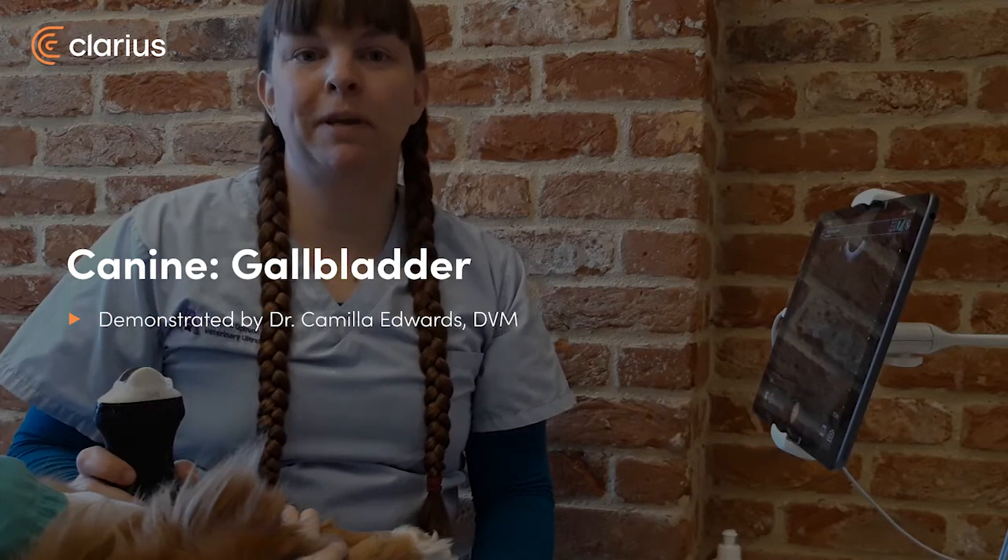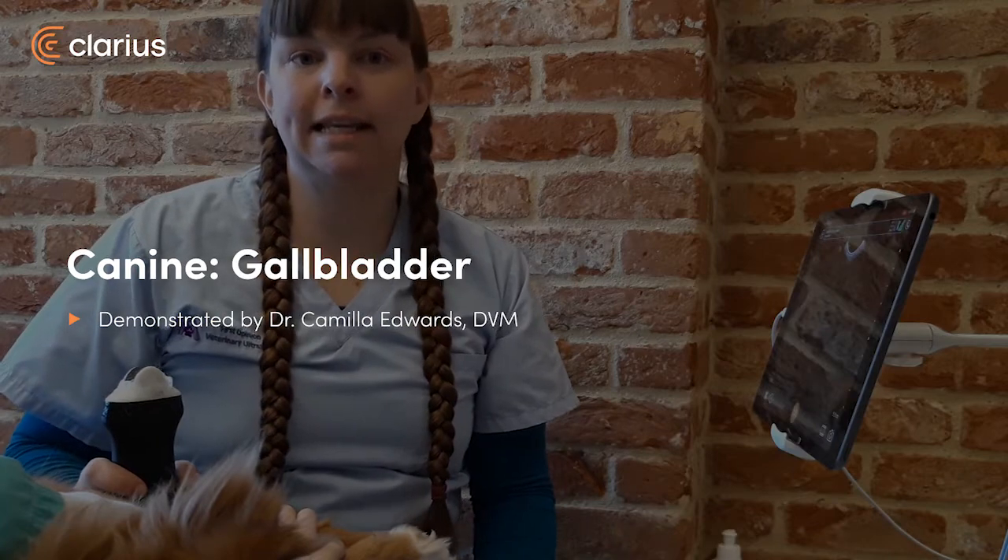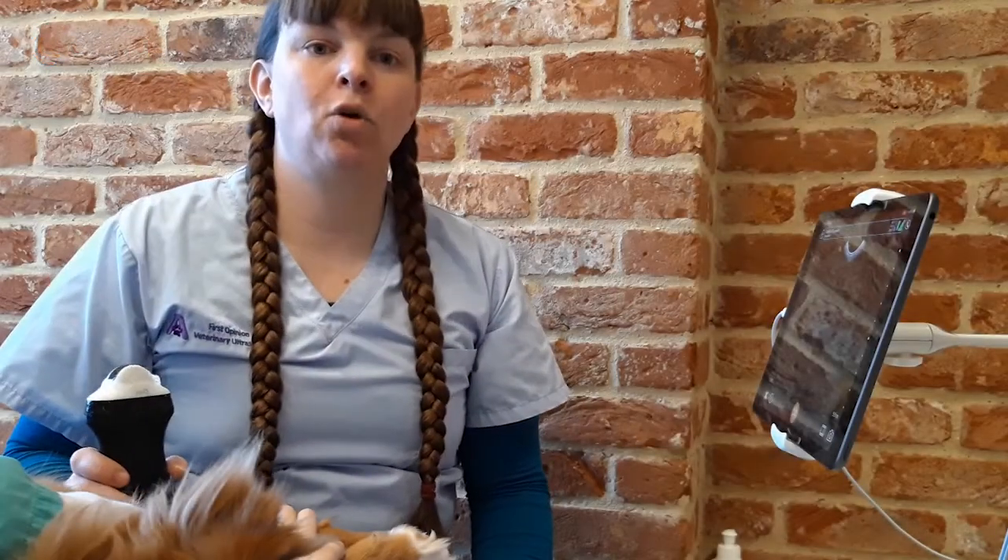Hi, I'm Camilla from First Opinion Veterinary Ultrasound. I'm going to demonstrate how to use the Clarius C7V to scan the gallbladder on a dog.